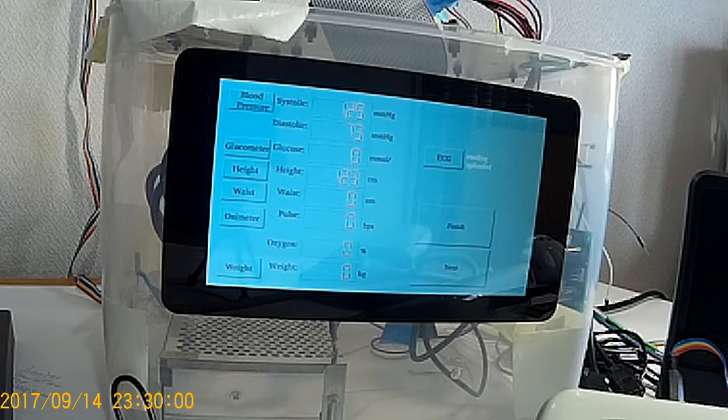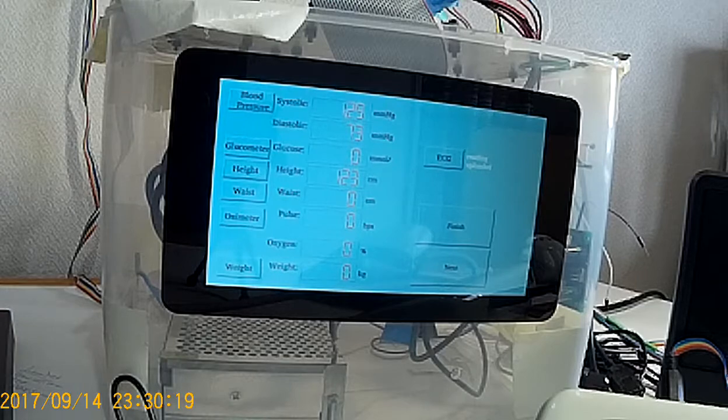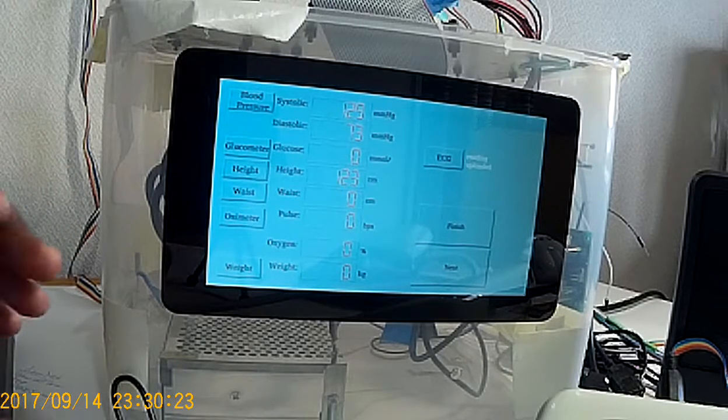This is how the EHealth kiosk is generally prepared, and future work can also come up with different outputs. On top of this video, I would invite you to check the website dedicated to the EHealth kiosk and see some pictures of the medical devices, for instance, what the glucometer looks like, and so on.